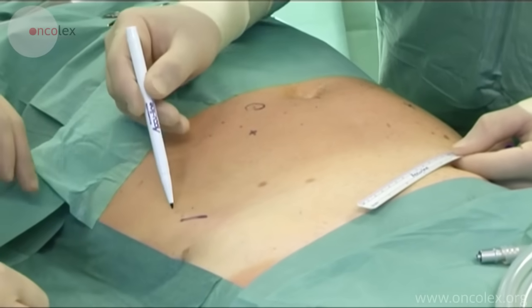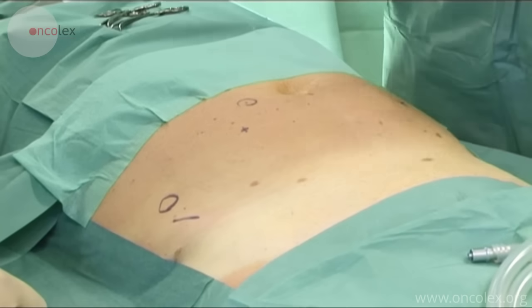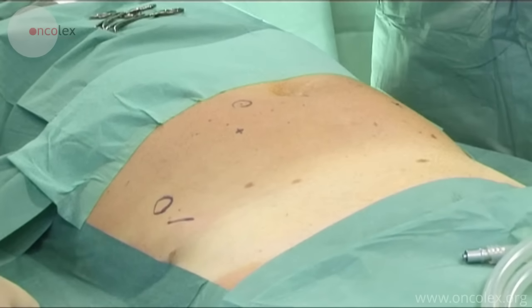Measurements are made for the placement of the laparoscopic ports. The first port for the robot camera is placed in the navel with a regular 12 mm laparoscopy port. There are two special ports for the robot, which are placed lateral to the rectus abdominis muscle. The last ports are two regular 12 mm laparoscopy ports on the right side of the patient, for the assisting surgeon.